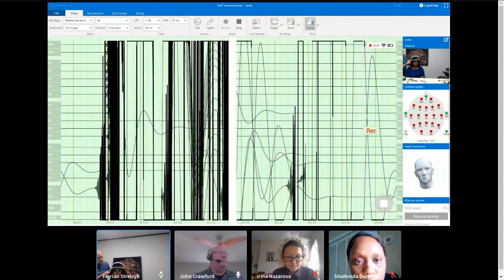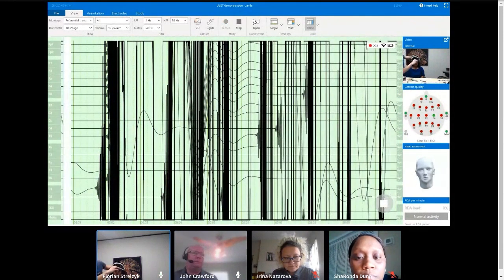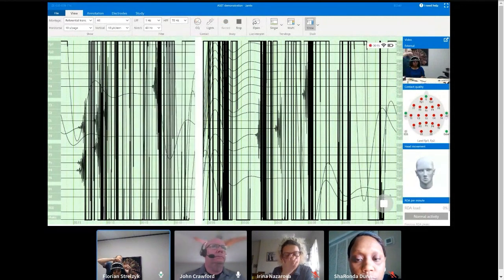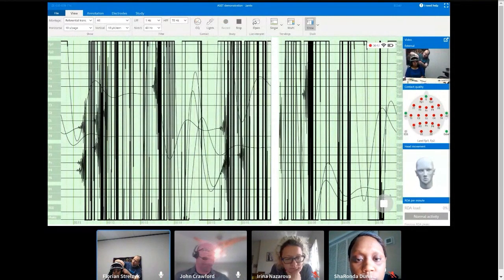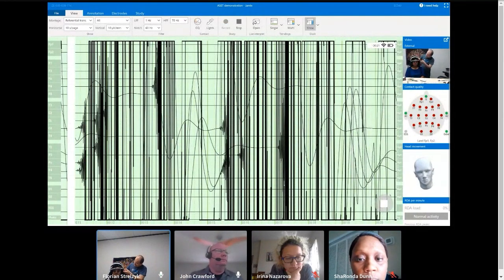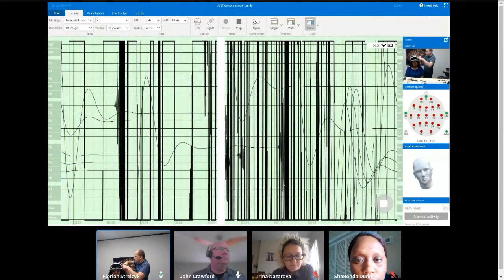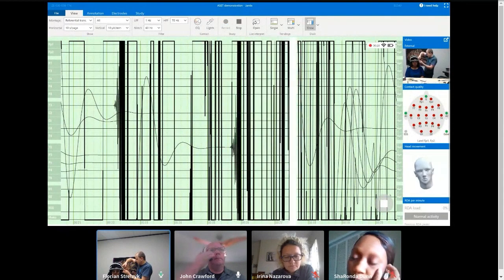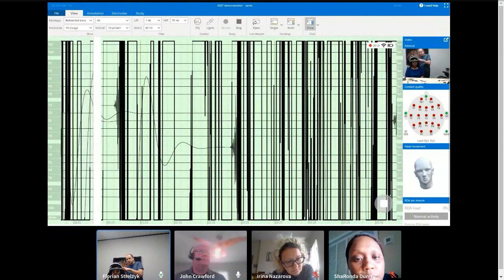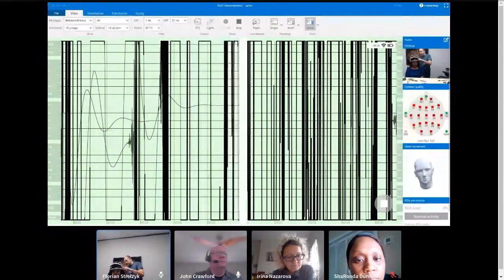So again, my first goal here is to make sure that my electrodes don't have a bent leg or something, and that I'm generally good with the positioning of the headset. And what I'll do here, there's a few nice braids that will show us how the electrodes move past them. So I'm going to move my camera here in a moment so you see exactly how we deal with that.